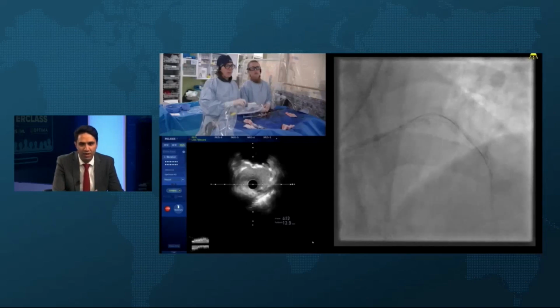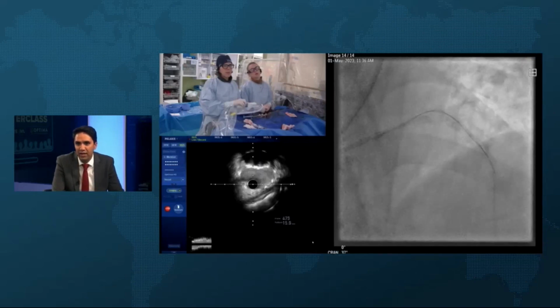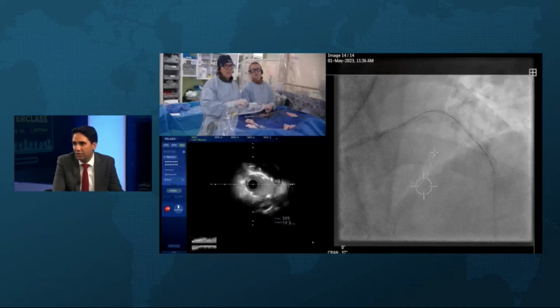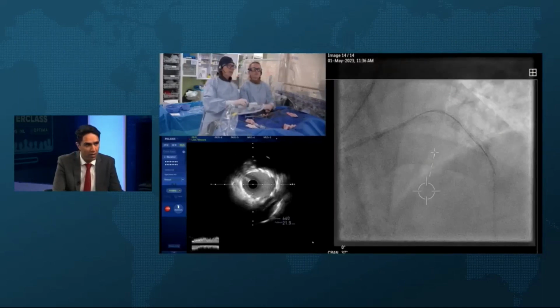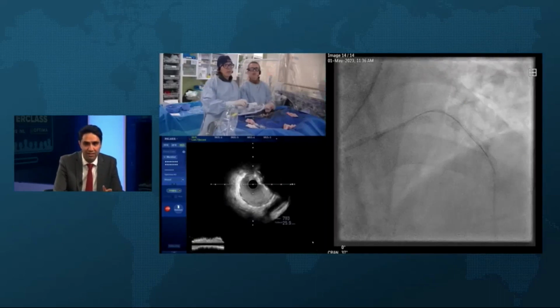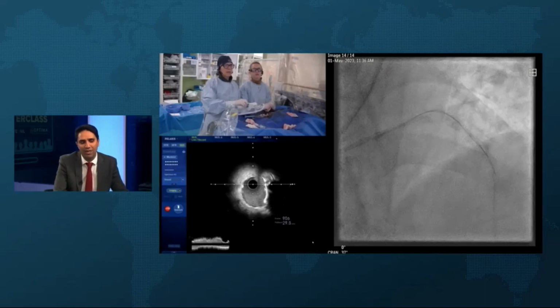I'm not surprised. You're not surprised I'm saying that. But the main feature is it does allow you to differentiate between eruptive nodule and protruding nodule, which has some clinical implication. And the second thing is it's just so easy to see the fractures. Yeah, absolutely. No doubt about that.